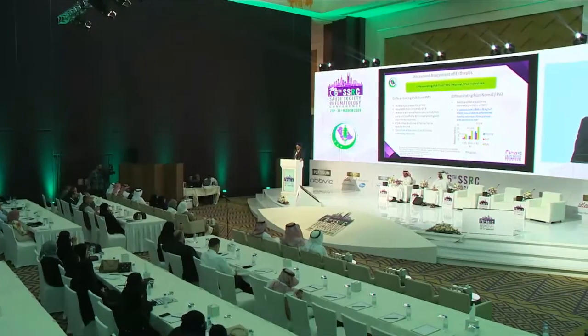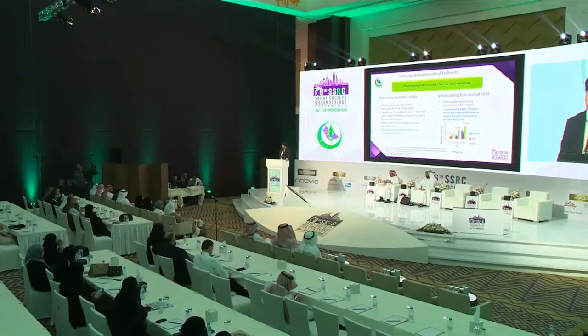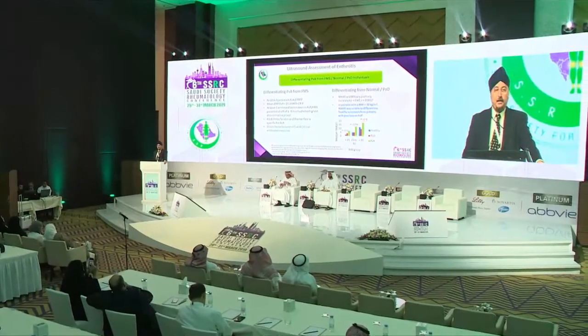So I think this is one area where there's big interest, and this is one study from Marchesini et al. on the left there that looked at 30 patients, and since then they're just about to publish a much bigger multi-center study from Italy showing that in psoriasis and psoriatic arthritis, you see much more enthesitis than in fibromyalgia. And in this small study, they said you have to have signals in at least three entheses rather than just choosing one. And this goes again to the point that there is biomechanical overlay. So you just can't say, if I just look at one enthesis, there's activity, you cannot say that's inflammation. So you have to have at least 3 or more. And in the new study, they're proposing looking at pairs.